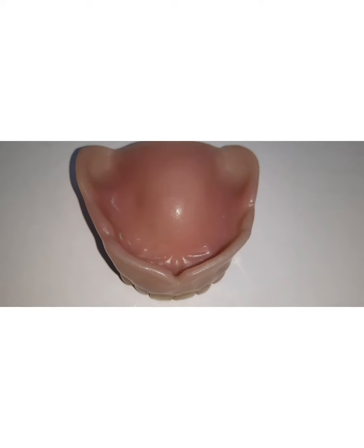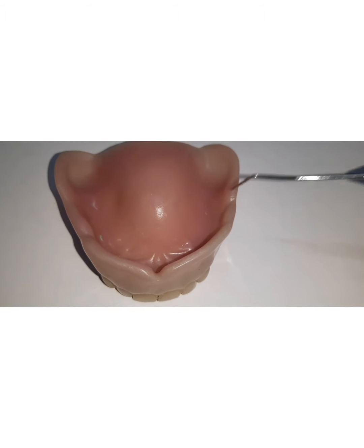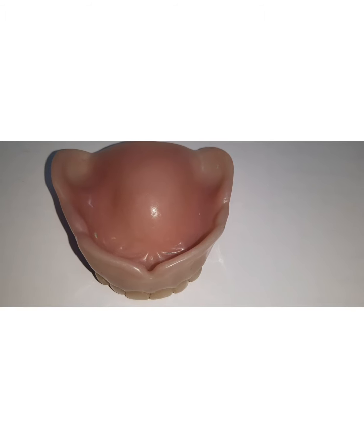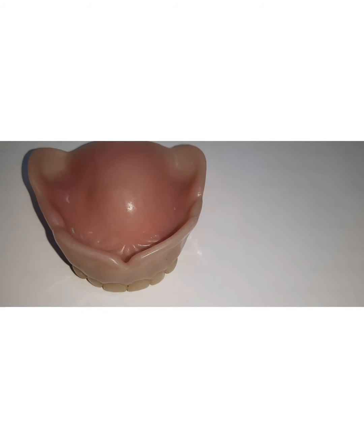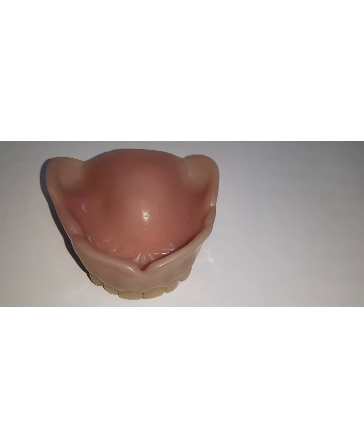Another thing which we need to keep in mind is the denture border should always be smooth and well polished, because if these areas are not smooth or well polished, then there will be denture irritation, mucosal irritation, which may cause soft tissue injury to the tissues. Any sharp margins will irritate, as I told you, the underlying soft tissues, and that is the reason they should be well rounded and well polished.